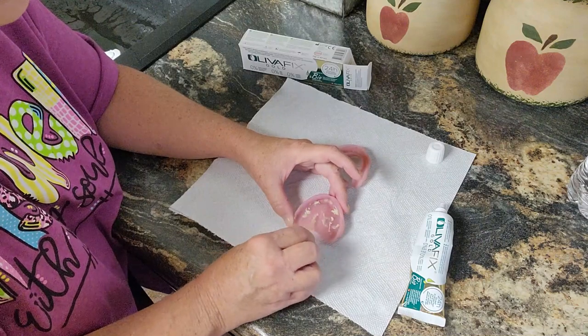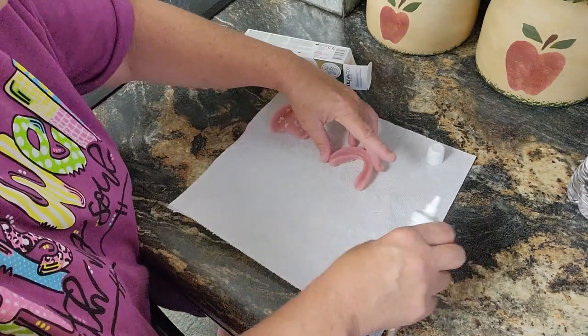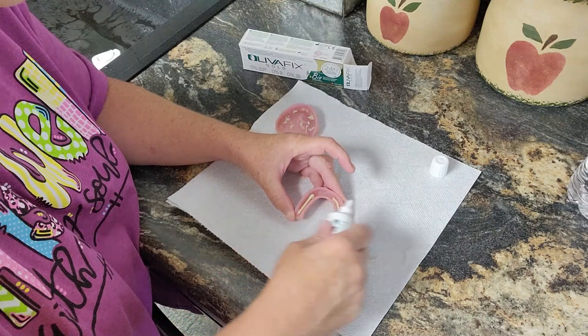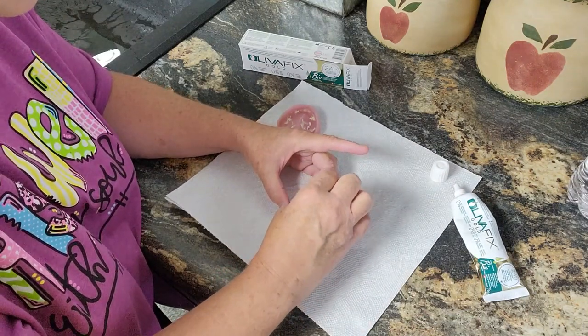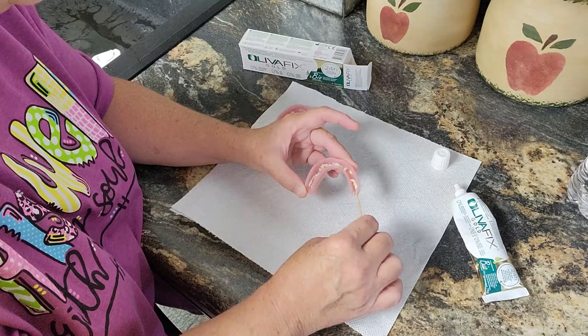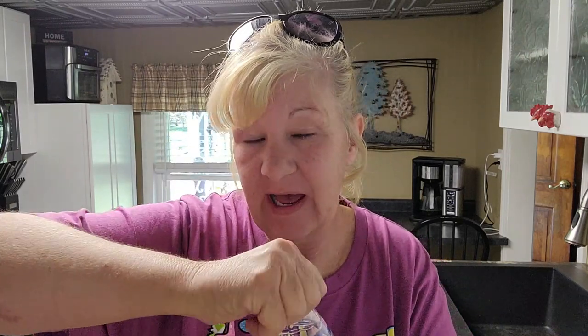I can tell you already that when I took this out it was really easy to remove the denture adhesive off my gums — the easiest I've ever had. This is exactly how it ended up the first time when I didn't hit the record button. Now it says to either put a spritz of water on here or take a sip of water, which is what I did before. It's not the first time I've not hit record on a video.